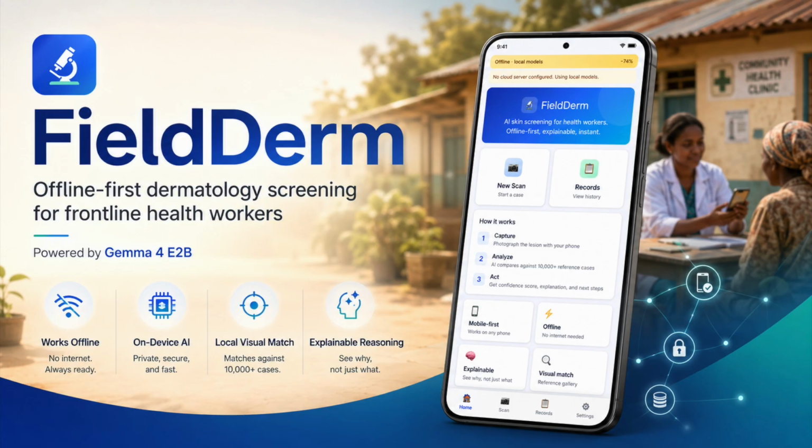When they upload images, based on the data and the new images, the app will find some similar images, which are later fed to the LLM. The LLM will check how similar they are. So we can deep dive into the architecture and how this is going to work.